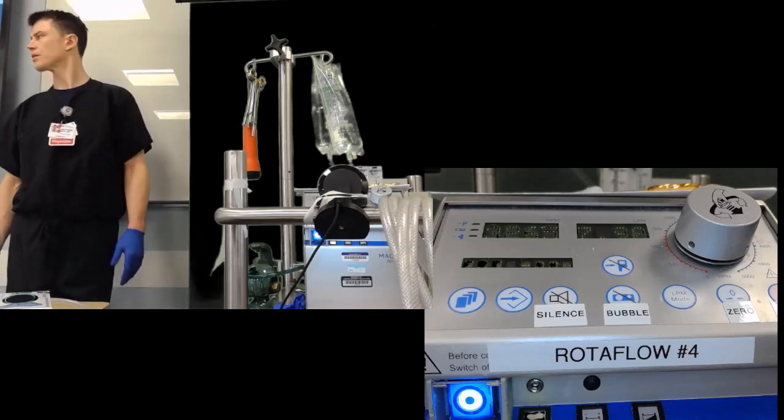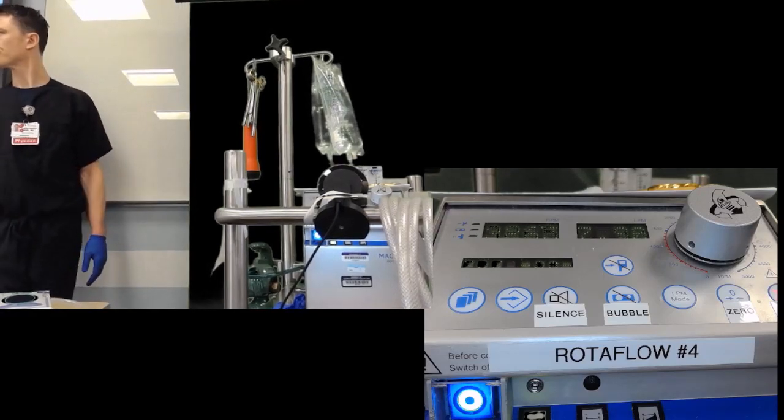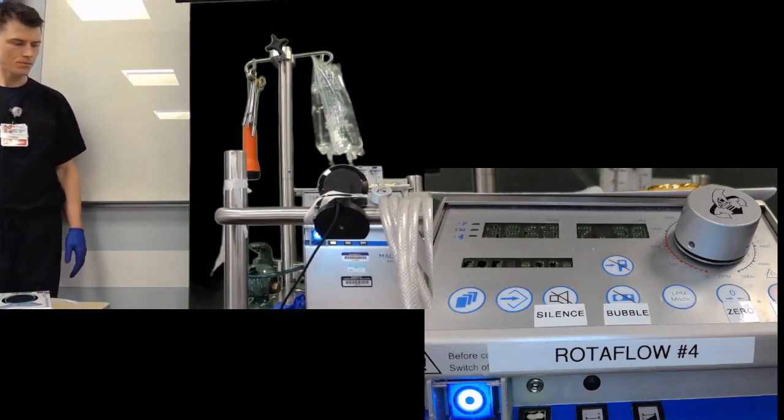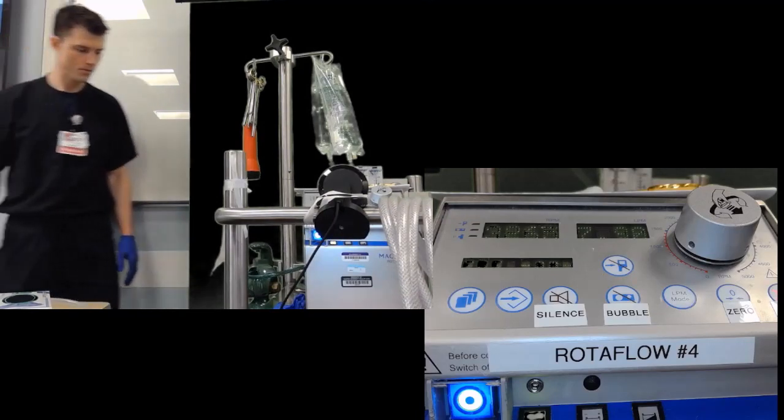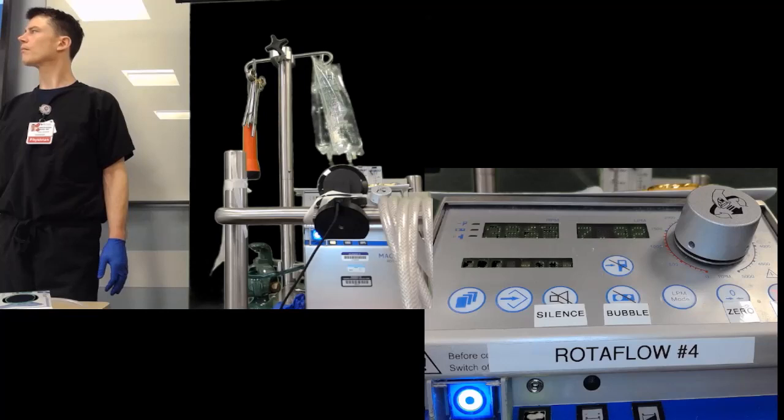Yeah, we had another one where the warmer was malfunctioning, and when the perfusionist clamped, they had to clamp water tubing when they changed it out. The warmer was fine, but they never took the clamps off. So that's another reason why the patient was hypothermic.